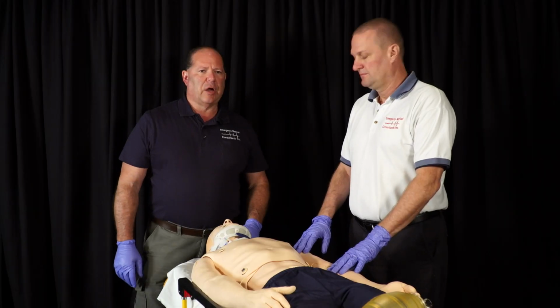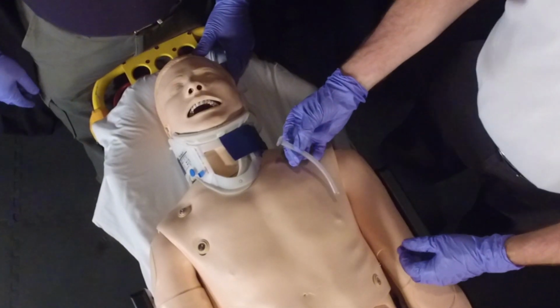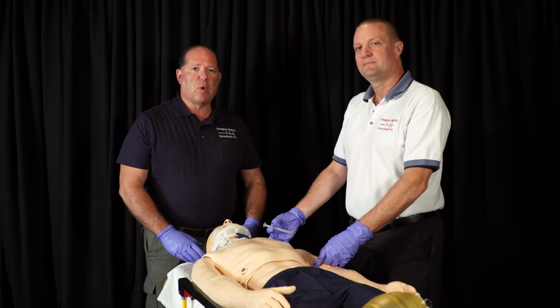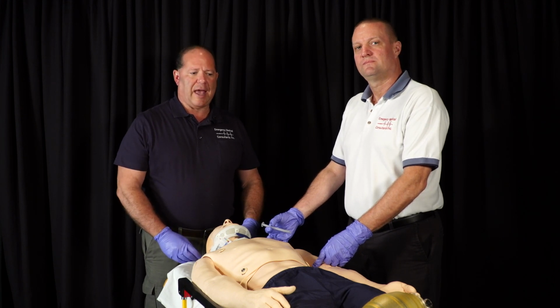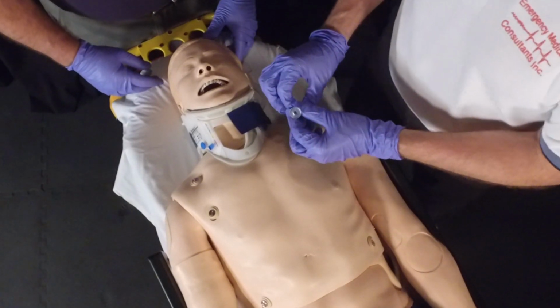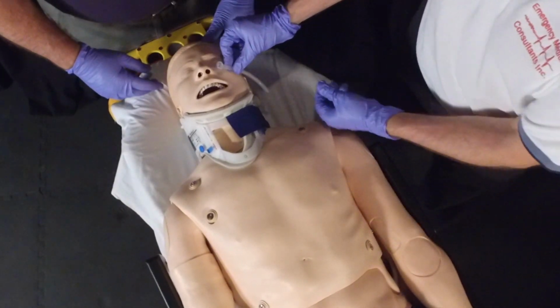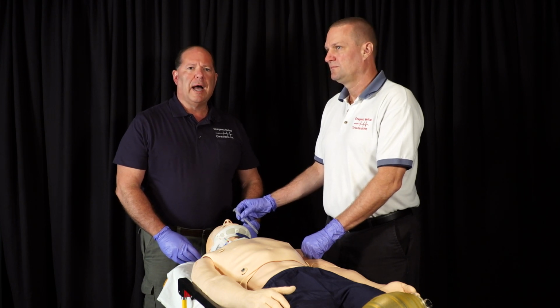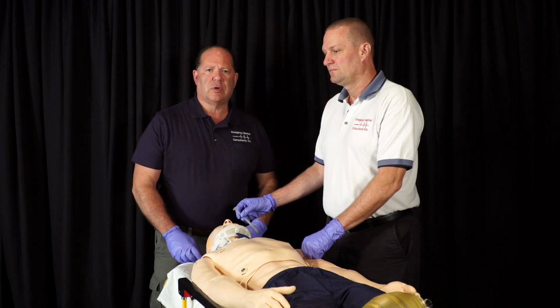The nasopharyngeal airway is used in patients who have a gag reflex who still need airway management based on the fact that they're snoring or gurgling. They're not able to accept an oral airway, like I said, because they either have clenched jaws or have a gag reflex. So this goes through the nose. Remember that we can't use this in patients who have significant frontal facial trauma or signs of a basilar skull fracture, such as bleeding from the ears, CSF from the ears, or a later sign, bruising around the base of the ears, or Battle's sign.